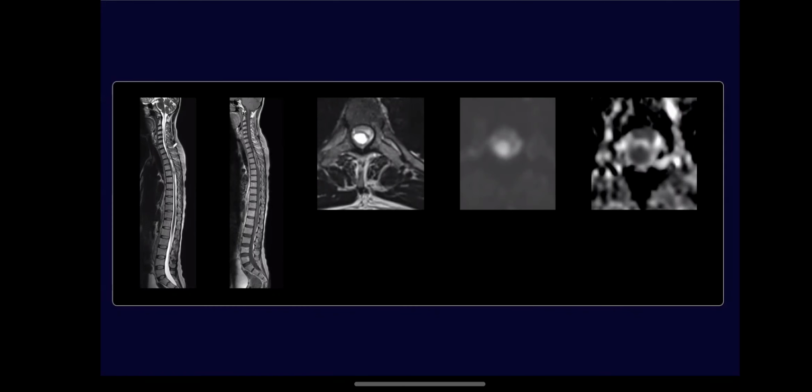You look at this and you see a peripherally enhancing lesion which is epicentered in the epidural space. We tailored the sequences and got the diffusion here because we knew with the peripheral restriction we were probably dealing with an infection. So we see the florid diffusion restriction, so we know at this point that it is an epidural abscess.